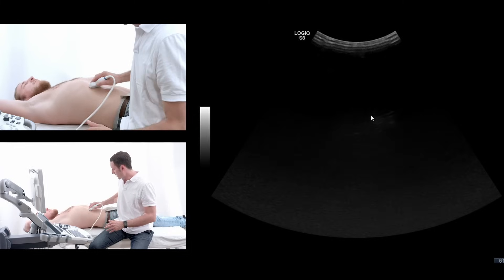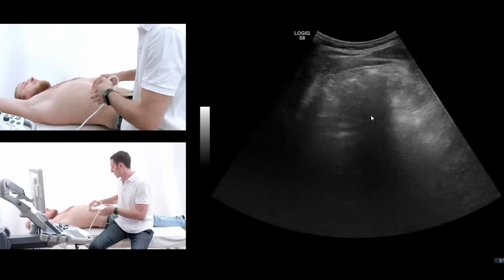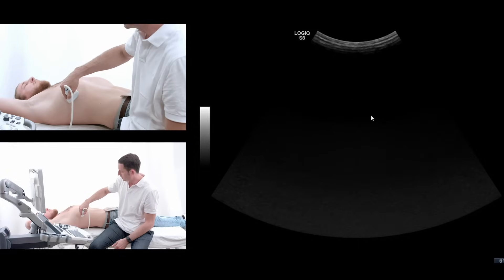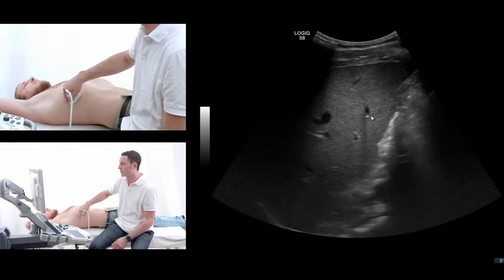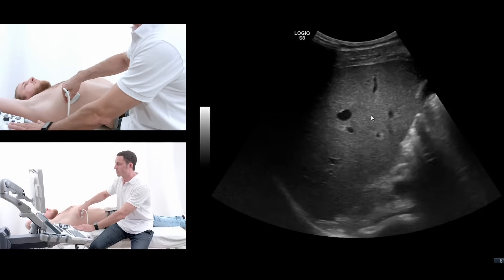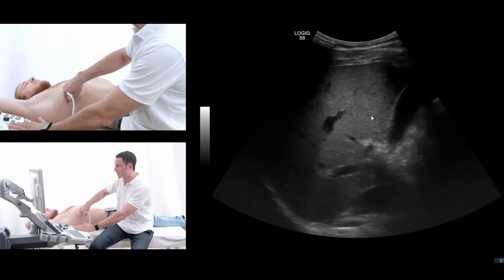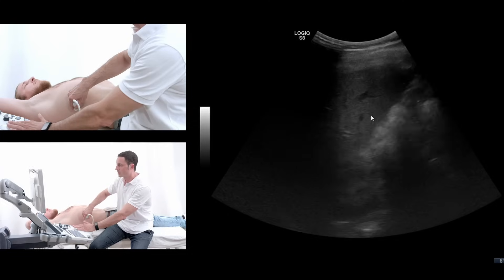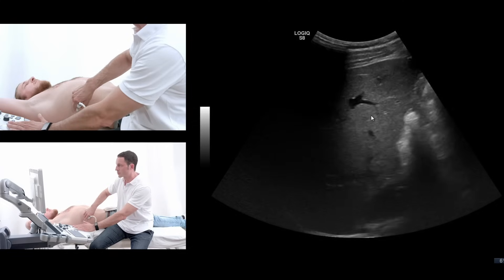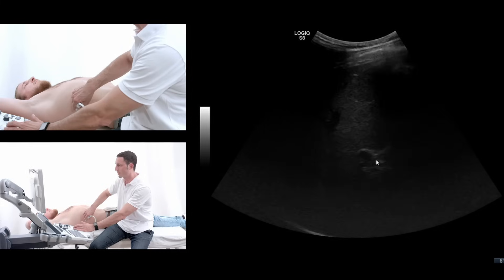When there's too much air in the colon so you cannot see the right liver lobe from the front, there's always a possibility that you go to a transcostal view of the right liver lobe. As you can see here, you can find a sound window where you can just tilt the probe at the same position and try to evaluate the right liver lobe through the costal view, which can help at the center sometimes when you don't see the portal vein.